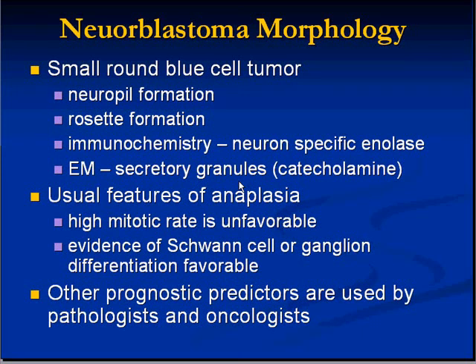The diagnostic classical microscopic appearance of neuroblastomas is pretty interesting. Classically, there are two terms that are used, which, if you see them, and they can usually be seen easily, pretty much cinch the diagnosis microscopically. And there are a lot of backup things we can do to prove it as well.